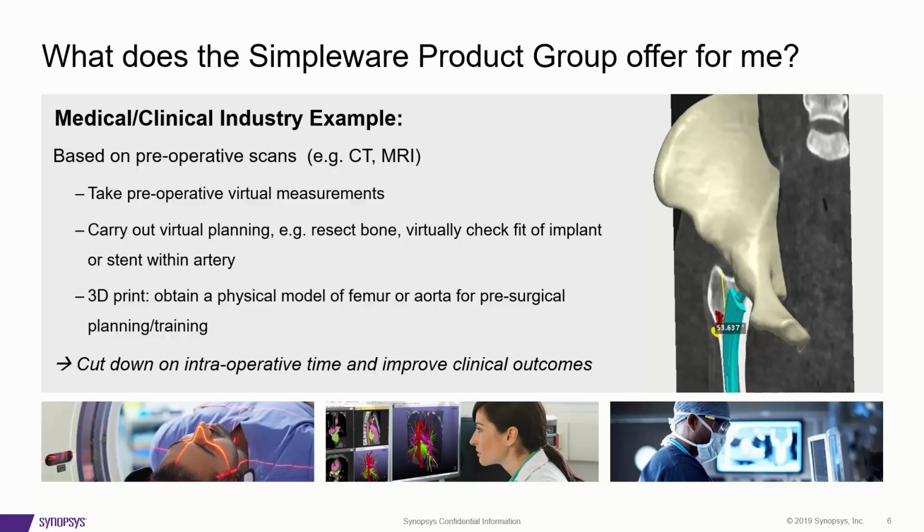So really our focus here is to aid the planning of surgeries and the assessment of treatments that need to be completed to enable patients to recover well from a surgery. Along with this process, in parallel with the planning process, we're able to allow 3D printing from the structures we segment.